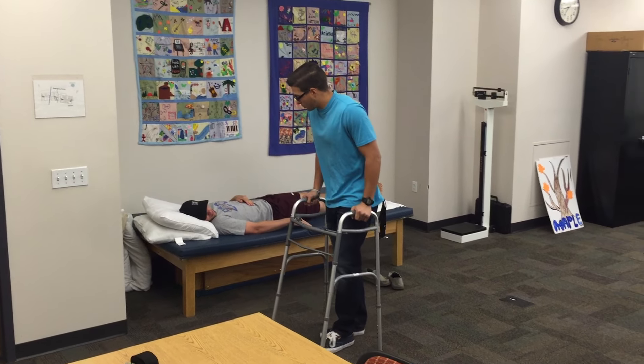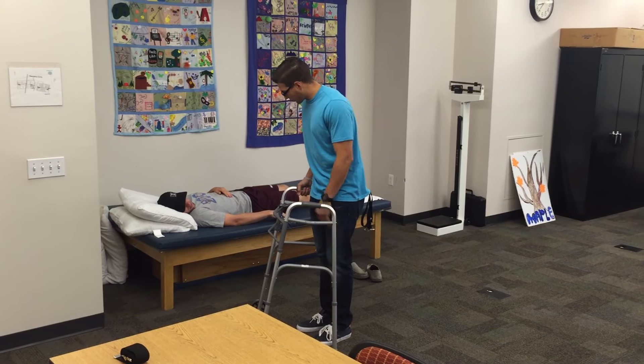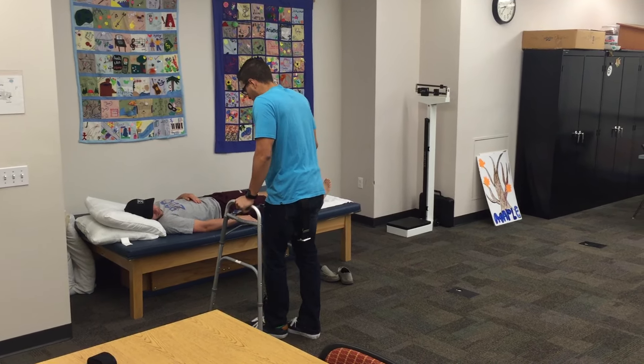Now when we start turning here, what I want you to do is turn towards the right side. I want you to kind of leave that left leg behind so it doesn't cross over towards the midline like we were saying. Just like that — don't bring it too far close.